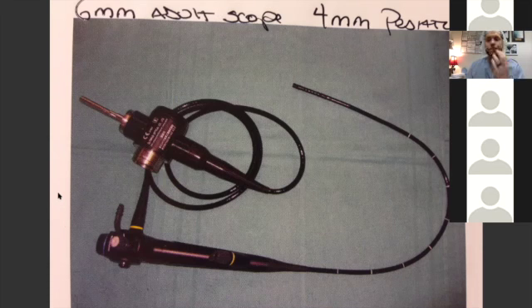Topicalize with a neb, put the local on my working channel. I go in the mouth and I go down to the trachea, right? It's not that tricky. Mouth, trachea. We're not making the left turn, a right turn, going up different lobes of the lung. We just got to go from the mouth to the trachea. So as long as you're topicalized and appropriately sedated, it can be a very successful venture.